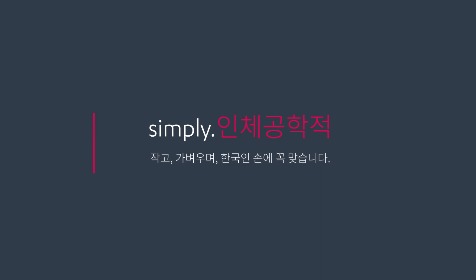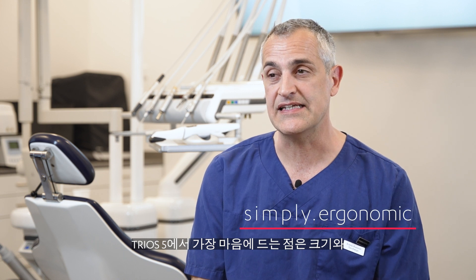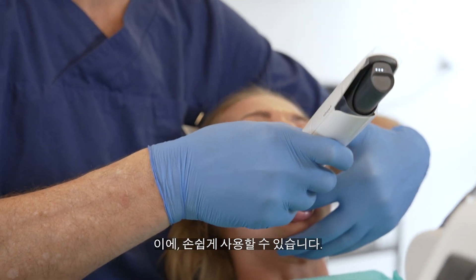My name is Eddie. I'm Mona. My name is Karsten Block. What I like most about the Trios 5 is the size. It doesn't weigh as much. It's maneuverable.